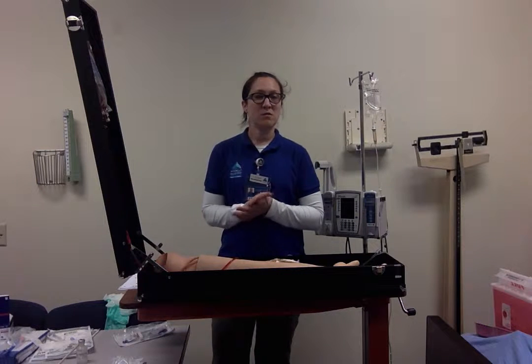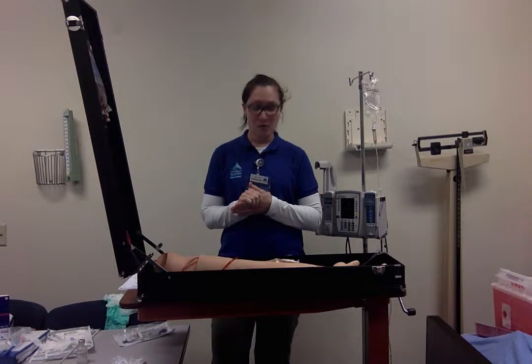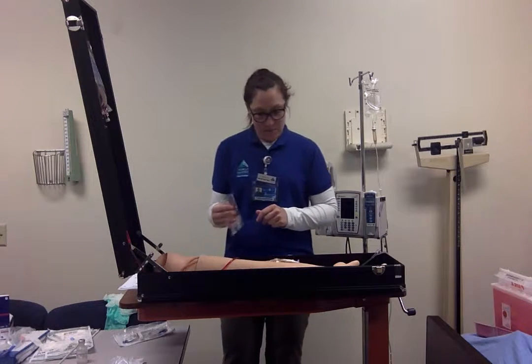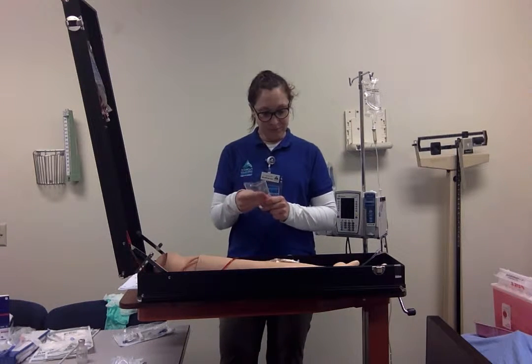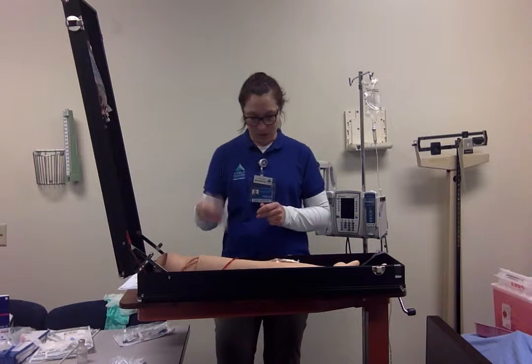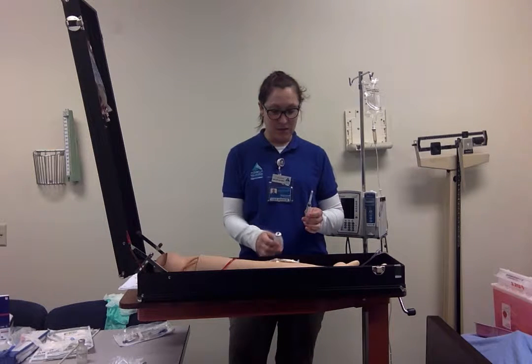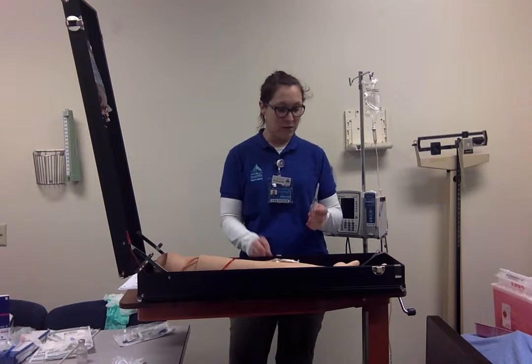Okay, next I want to assemble the correct medication. I have my piggyback bag. All right, first I want to draw up the medication itself, the Rocephin 2 milliliters.